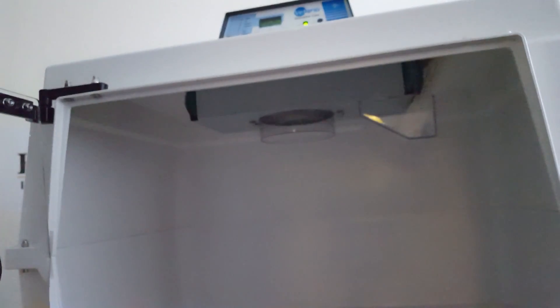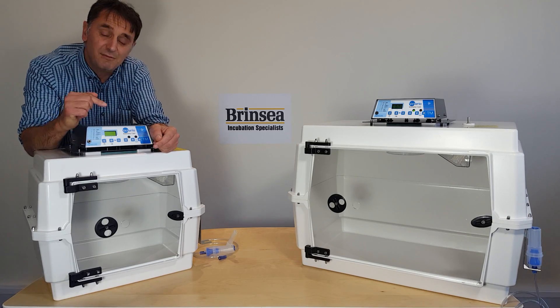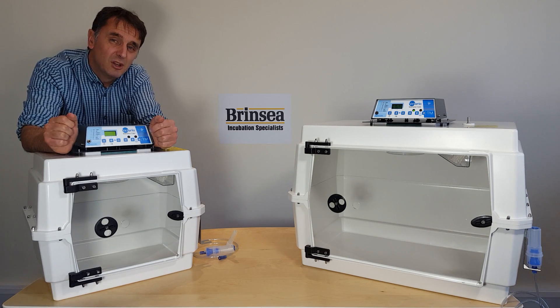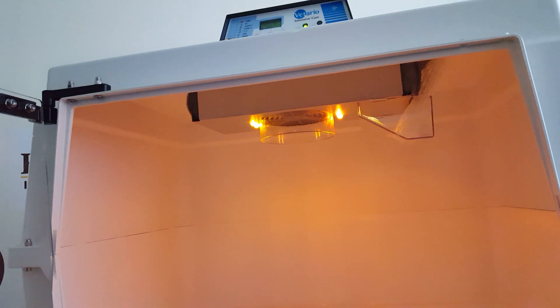The units are also equipped with a gentle internal amber coloured LED lighting for night time inspection of patients. The T40 has a single set of lights to the left of the fan, while the T50, because it's a bit bigger, has lights on both sides of the fan. The LEDs do not affect temperature and do not produce ultraviolet light often associated with white LEDs.